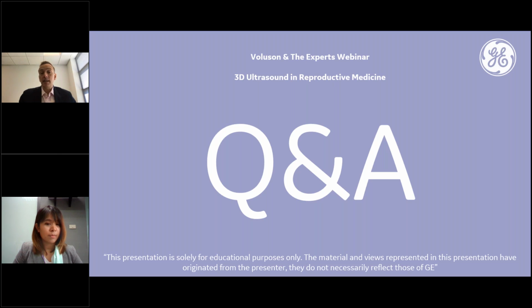It's a beautiful technique when we've got these pregnancies that are high in the uterus. If you do a 3D image, TUI or a render view, or just simply using the multiplanar view, the patient will say to you, that looks like it's in the cavity, or it really makes it crystal clear. I don't think you can do it with 2D. I'm sure some people who've been scanning for many more years than I have can, but what they're doing is creating a 3D rendered or TUI image in their head.